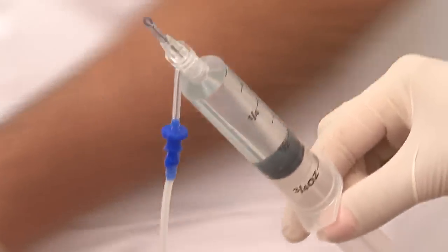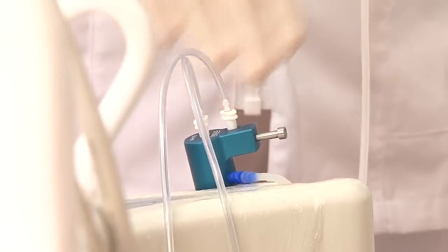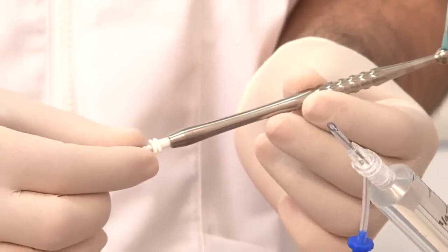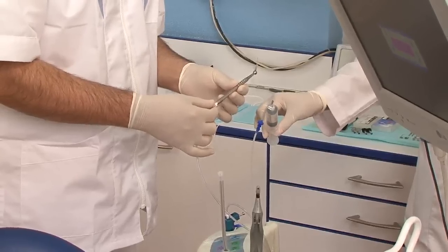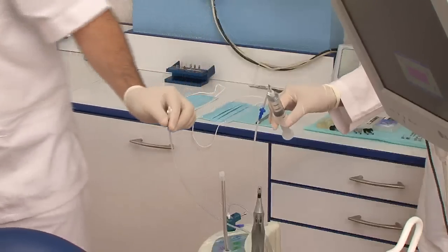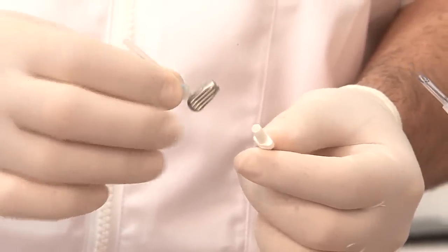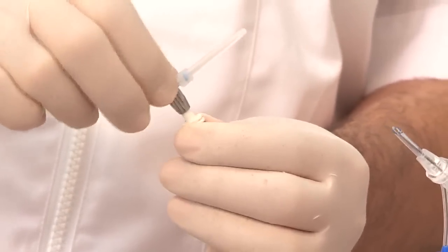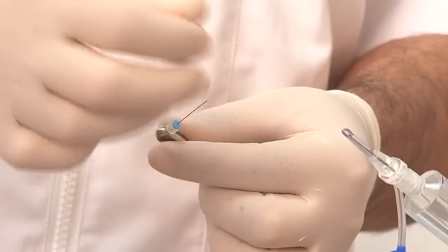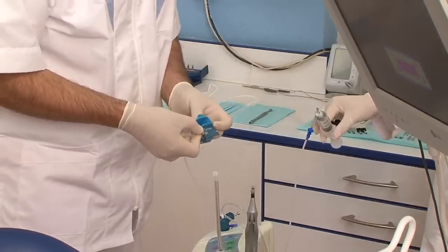This is the master delivery unit. This is the macro cannula, and we take the second part of the white tubing and we connect it to the handle, because the first part is the only part that is connected to the suction device. And the same one can be connected to the micro cannula tubing or handle that is going to create the negative pressure at exactly your working lengths and create this current of fresh irrigant inside the root canal system. We adjust it to the exact working lengths and it's ready for use.